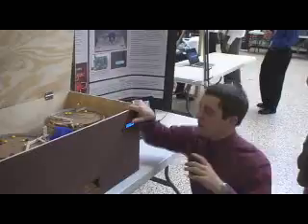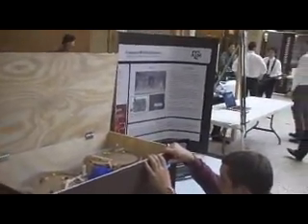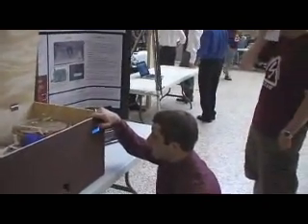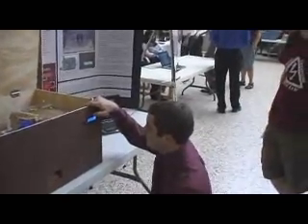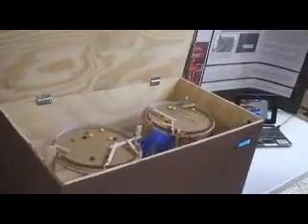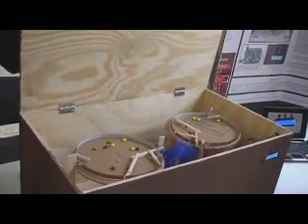Sometimes I think it's a connection issue with the switches that we have. Sometimes it'll jump two minutes, so there's some more debugging there. Right now it's going to be 1 o'clock and 1:15. They're going to be doing 2 pills each. It's hard to tell, because sometimes when you push it once, it's actually incrementing the clock and you push it back. There's a little bit of a risk of that happening. It's just kind of a waiting game now.